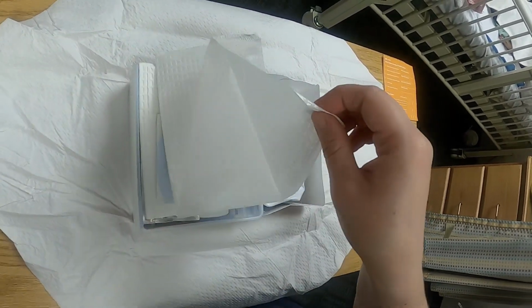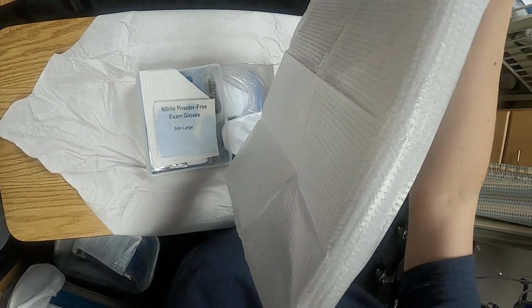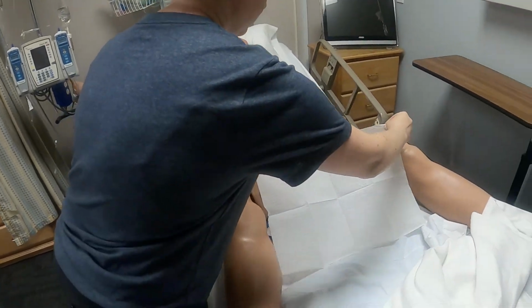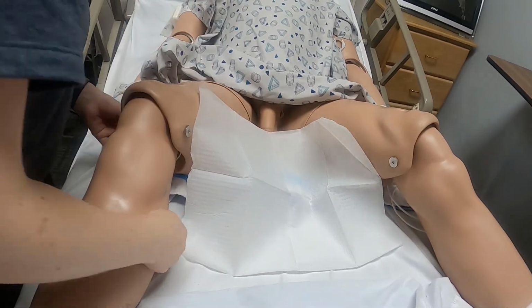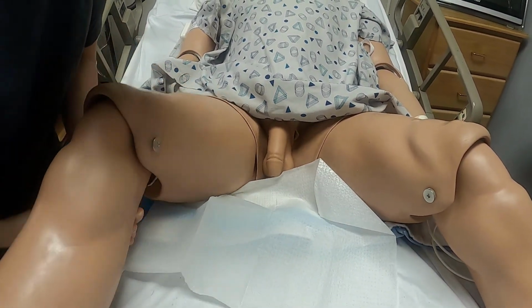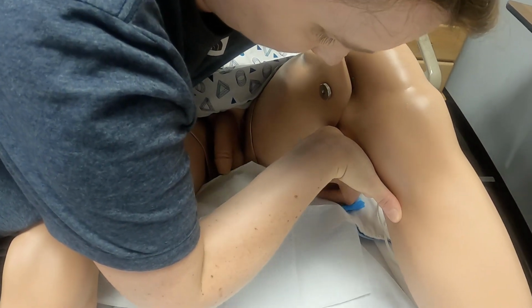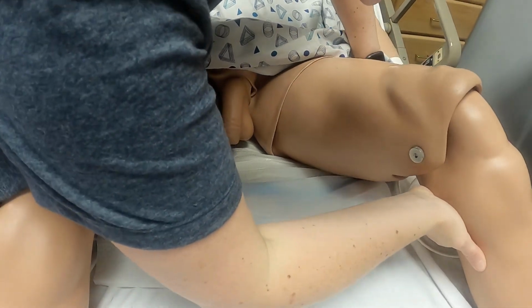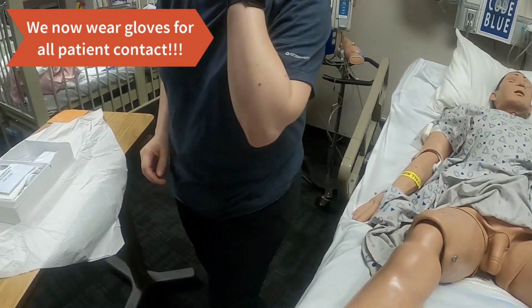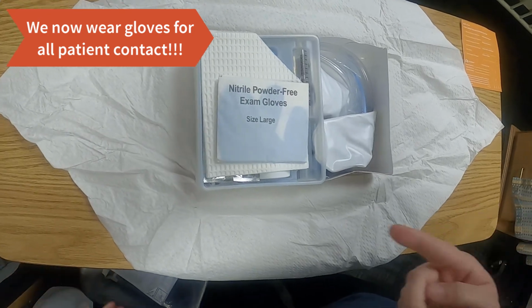Now we're going to get our little sterile field. Okay, so touch it the least amount possible. Shiny side goes down. We'll move it over and try to put it under him. So the best way is just lift up one of his legs on underneath, and then the same over here. Okay, so this here is just an extension of your working field. We'll put it underneath as good as any way possible. So there you go.